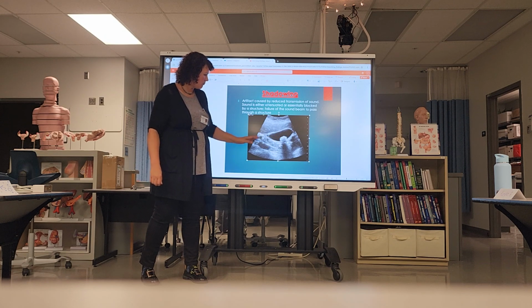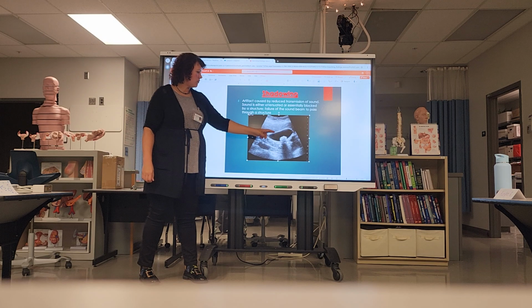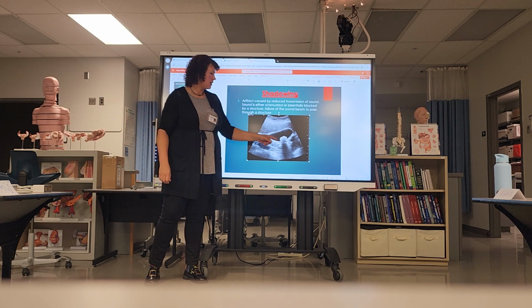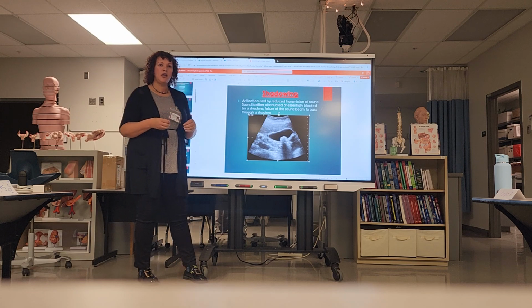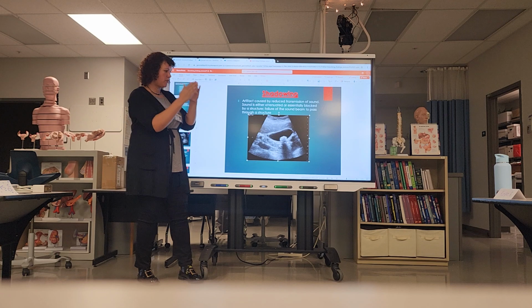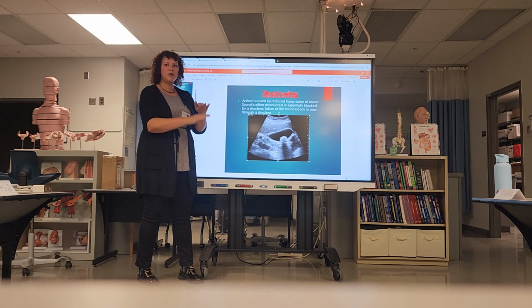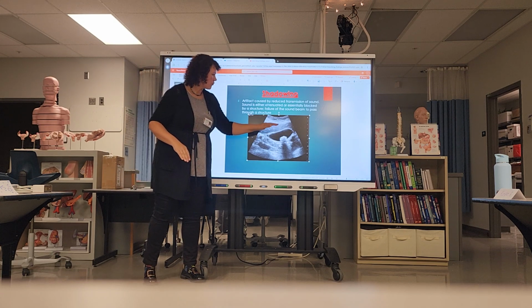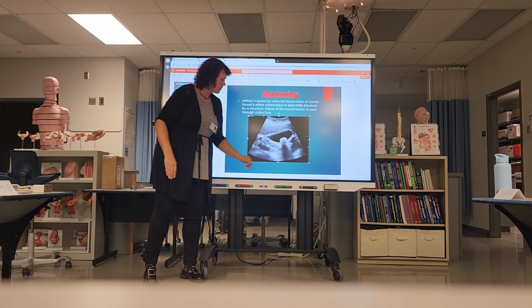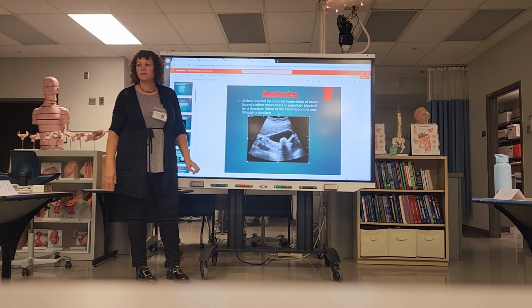I don't see another bone in this image, but your bones will show up very, very bright, just like this, because bones are calcified. And the ultrasound beam cannot pass through bone. So you'll have posterior shadowing underneath it. So anything that is really, really, really dense, you'll have posterior shadowing. Any questions about that?